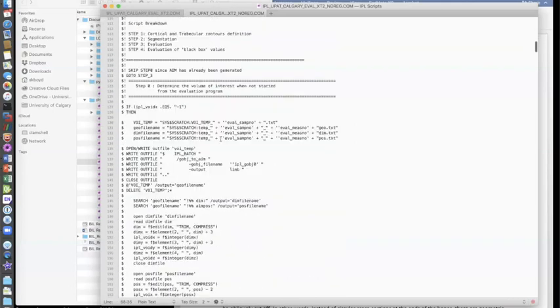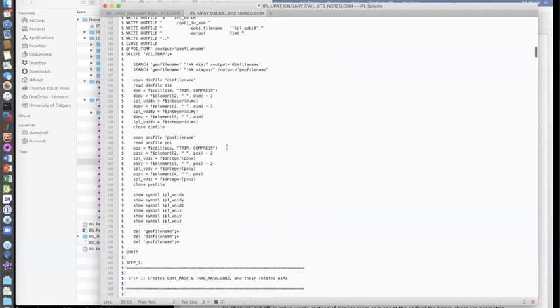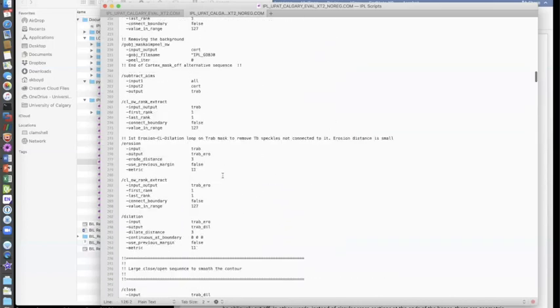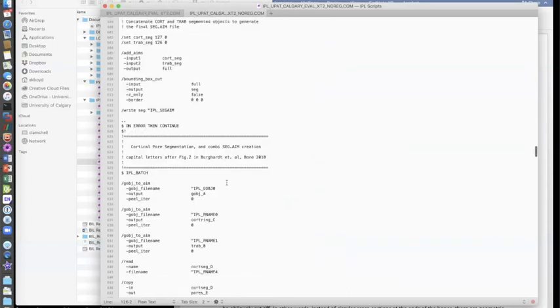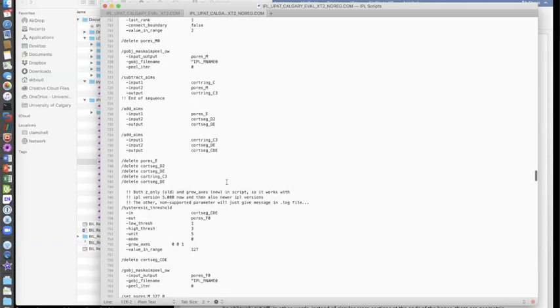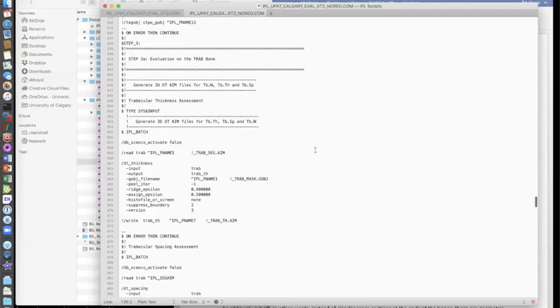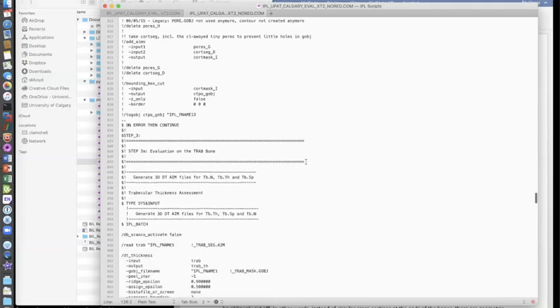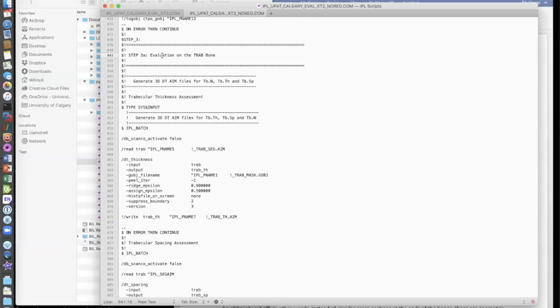Once we're into this file, what it's doing is a morphological analysis, and it calculates all sorts of things that you would normally expect, you know, BMD. It might even do the segmentation for you, and the auto contouring. I can't remember if we run that all the time, but I could just look at the script to figure it out. I'll let you do that if you want. But after we've got the segmentation done, we come down here, and now again more preparation for the analyses, and then we finally get, where is it? The evaluation. So now we're going to start actually measuring things.